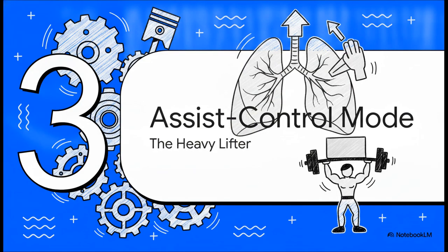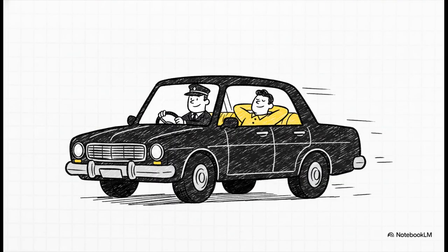Part 3. Assist control mode, or AC. Assist control is the heavy lifter mode. The ventilator is basically acting as your chauffeur here, ensuring full support during every single breath.